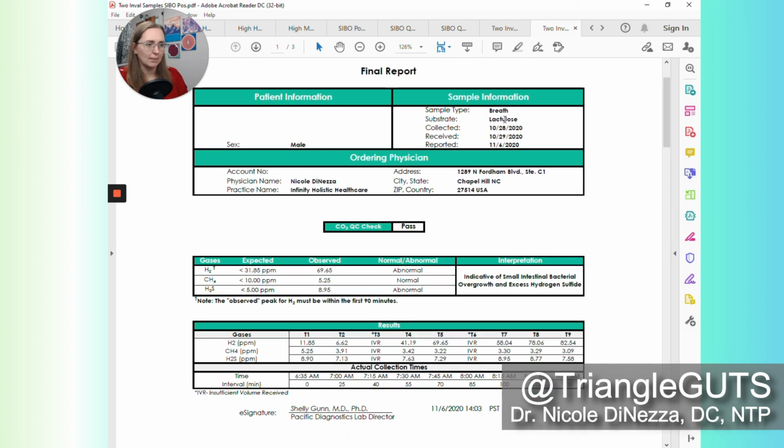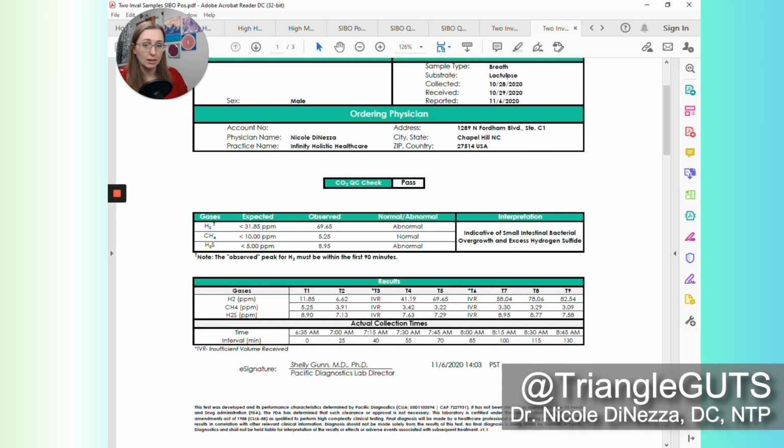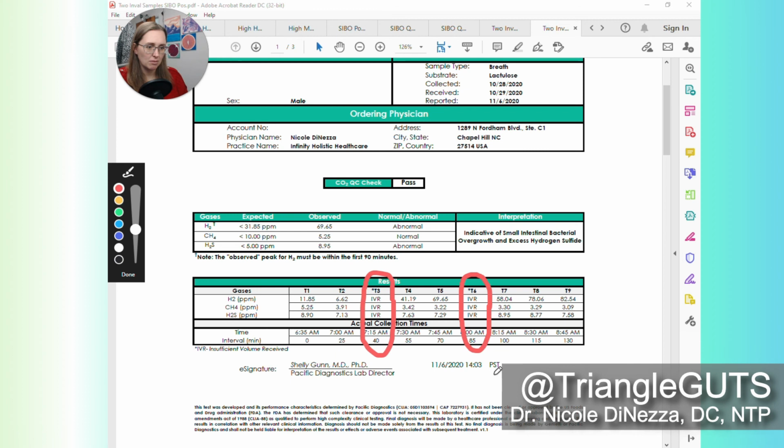All right, last one. This is another lactulose test. You can see this one's going to be a little squirrely to interpret. Sample number 3 is invalid and sample number 6 is invalid. Now, sample number 6 is at the 85-minute mark, and since we're testing with lactulose, that probably doesn't really matter. But sample number 3 at the 40-minute mark sure as heck is going to matter to us. So let's go find out what this graph is going to look like.